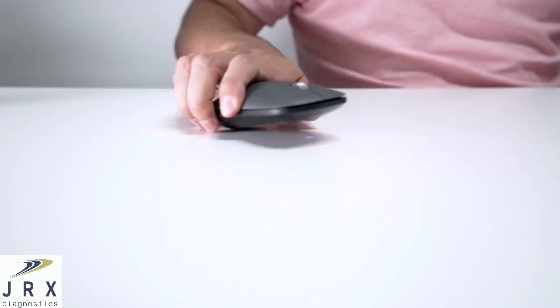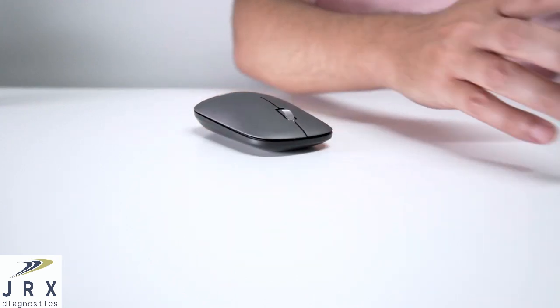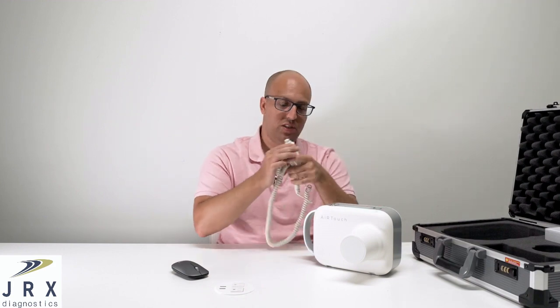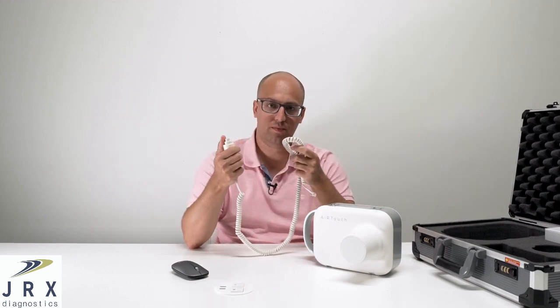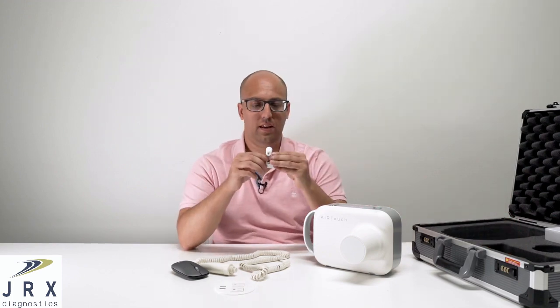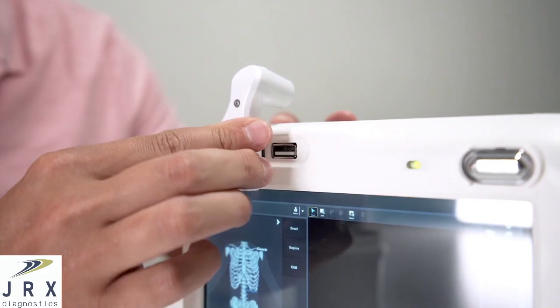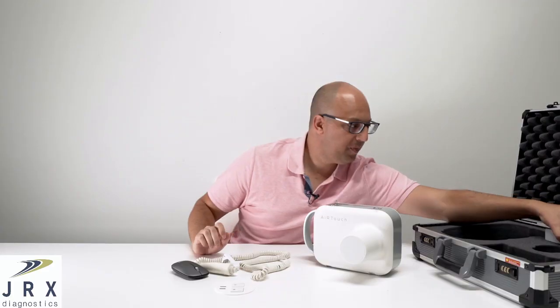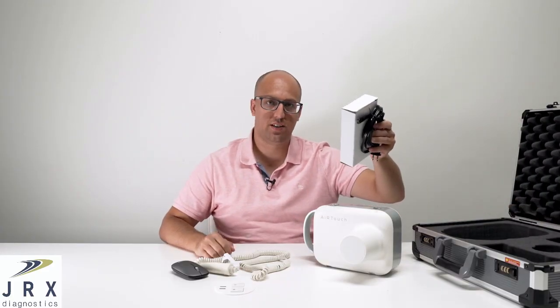It comes with a wireless mouse to operate the system if you feel more comfortable, a two-position hand switch with a coiled cable, a laser light that plugs into one of the USB ports to ensure that you're aligned, and all of the charging accessories.